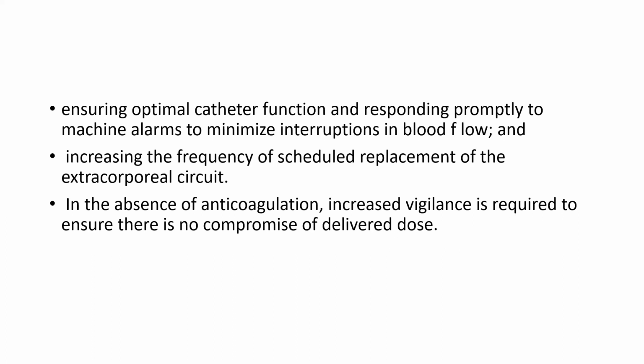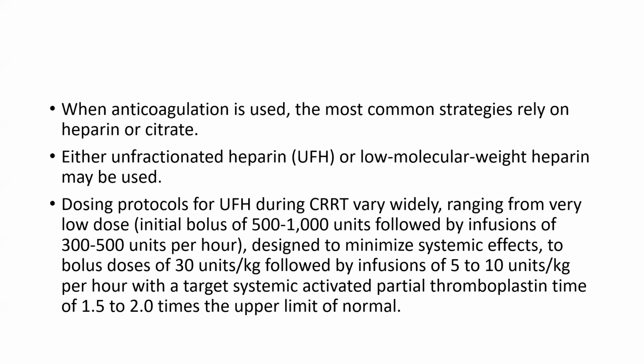Ensuring optimal catheter function and responding promptly to machine alarms to minimize interruption in the blood flow. Increasing the frequency of scheduled replacement of the extracorporeal circuit. In the absence of anticoagulation, increased vigilance is required to ensure there is no compromise of delivered dose.